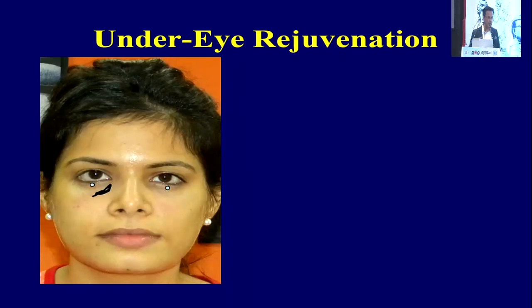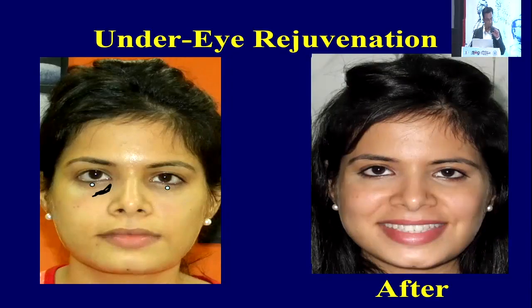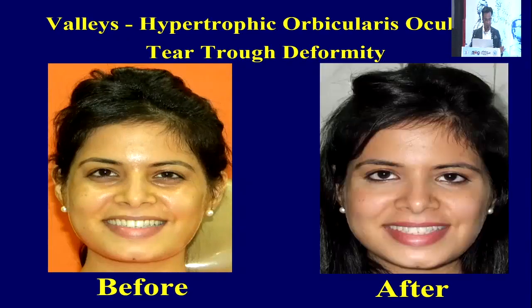And then just a little bit of fillers, which is done with the bevel down, a low G prime filler, which is done in the tear trough deformity, and the objective of this is to fill up the trough. The moment you do this, this is how she looks. The moment she smiles now, you can see how symmetrical she is. So she's literally gone from there to there.